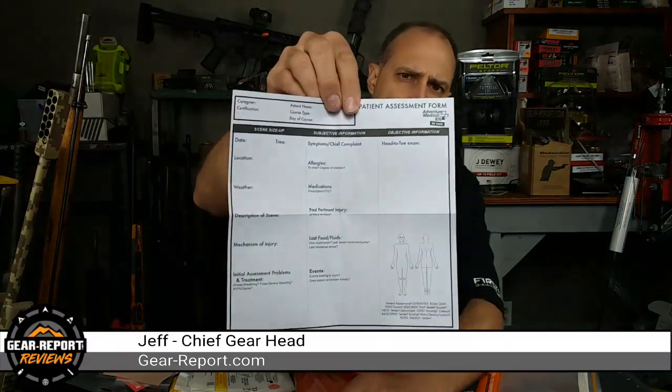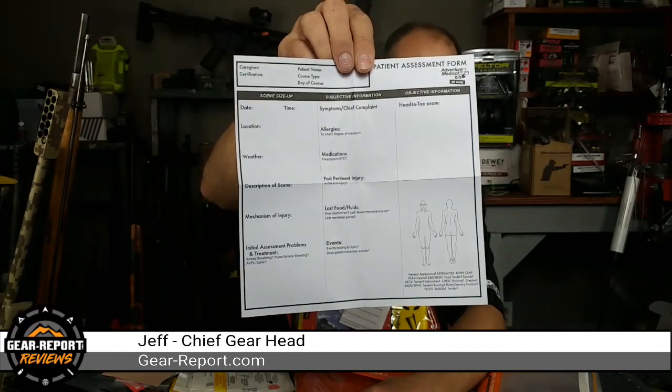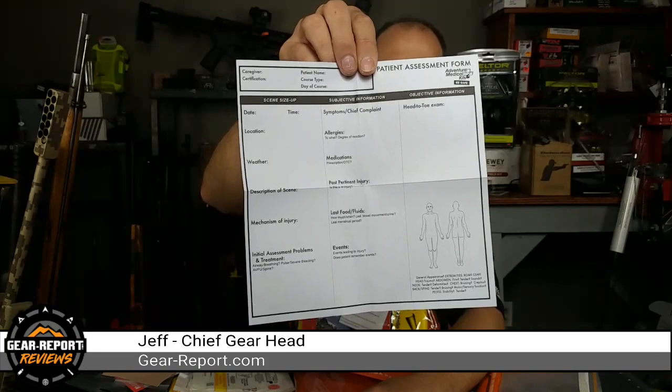Okay, the pencil I showed you earlier would be used for filling out this patient assessment form. This is really critical. Obviously, you need to stabilize someone who is bleeding out before you stop and write stuff down, but as soon as you get a chance that the person is stabilized, you can document everything that you did.